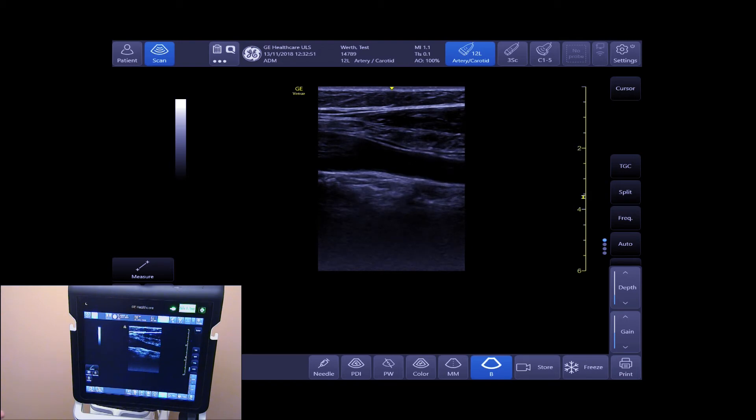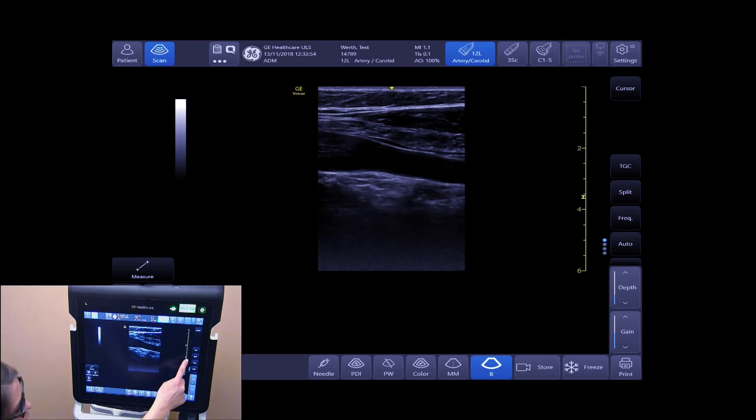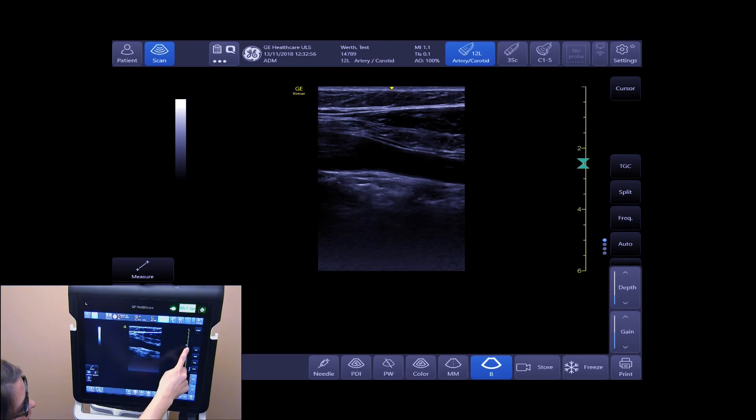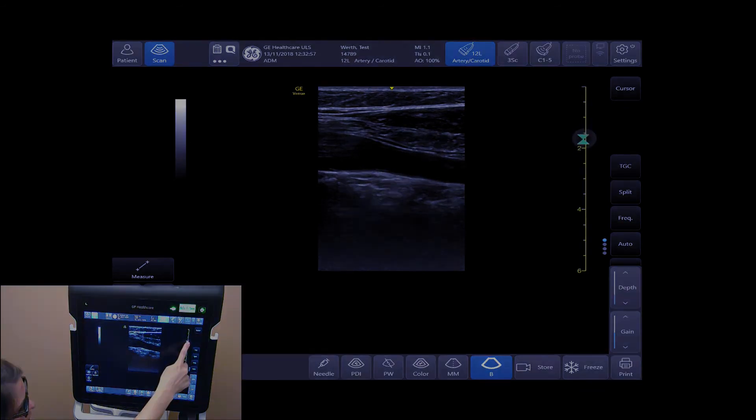To adjust your focus position, tap on your focal point and move it up and down.